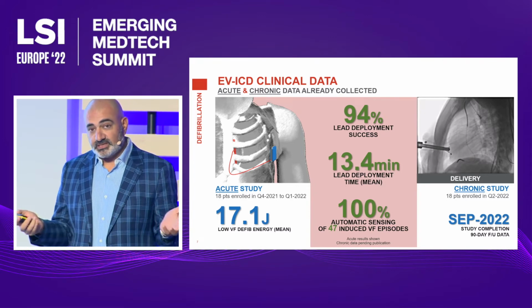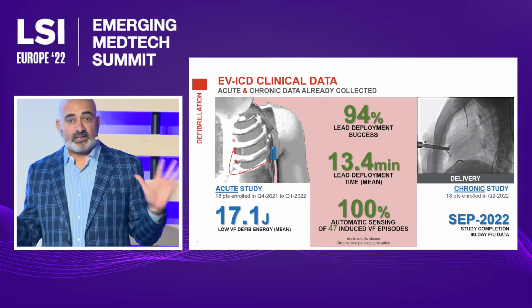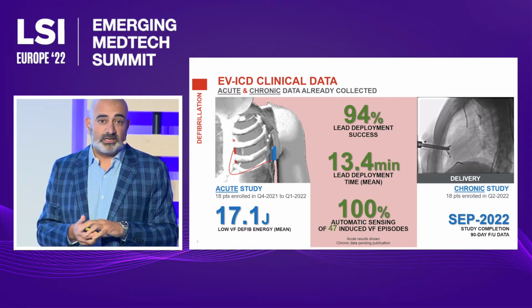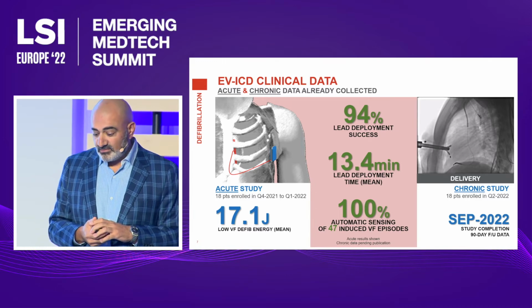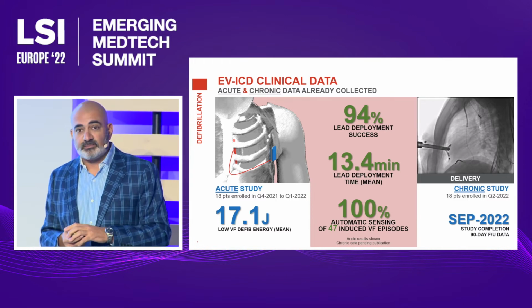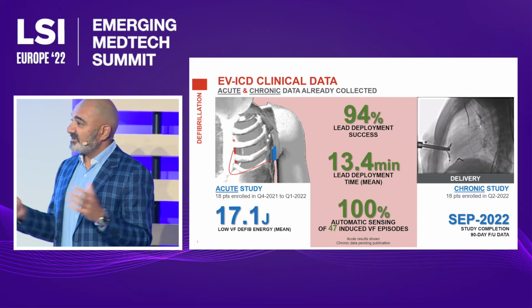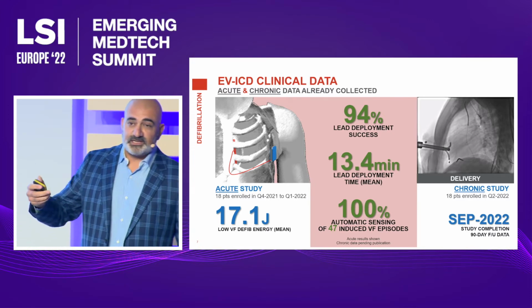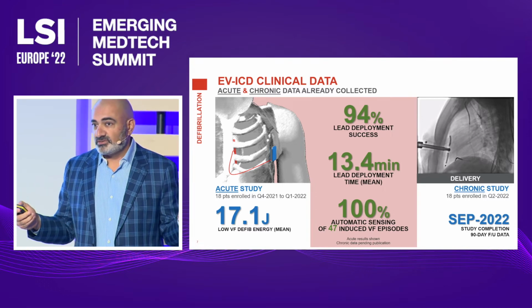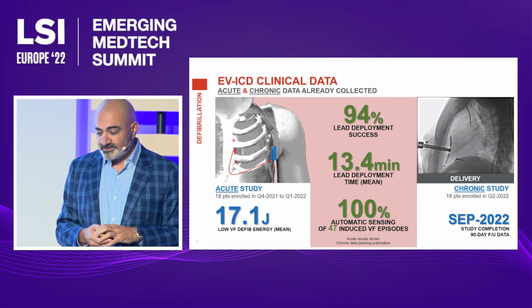We've been inducing VF, so we induce ventricular fibrillation in the operating room, sit back and let the devices recognize that, deliver the energy through our lead, and every time we've done that with 4 different manufacturers now, that signal is sensed and automatically triggers the shock delivery. And there you can see our mean energies at 17.1 joules. Those in the space will recognize well within the capabilities of existing architecture. Most devices are about 40 joule systems now, so plenty of headroom for us there.